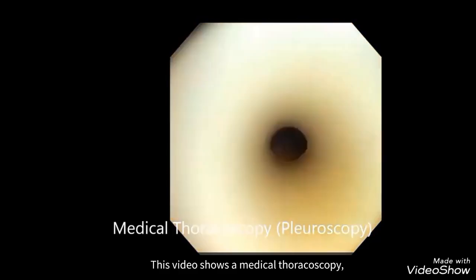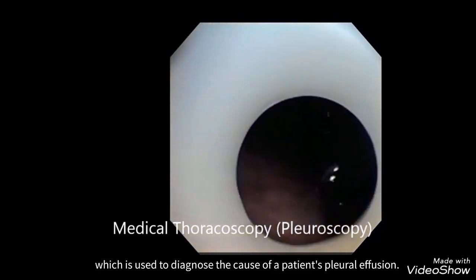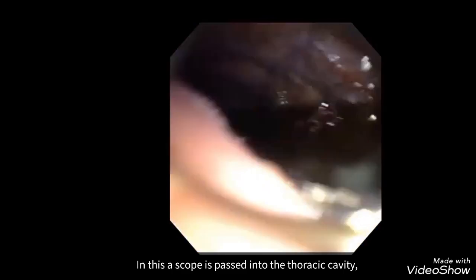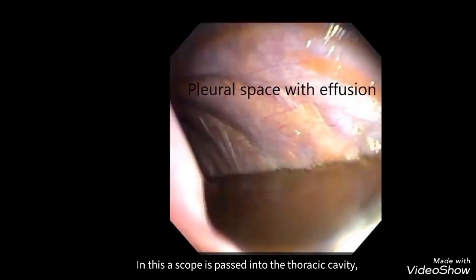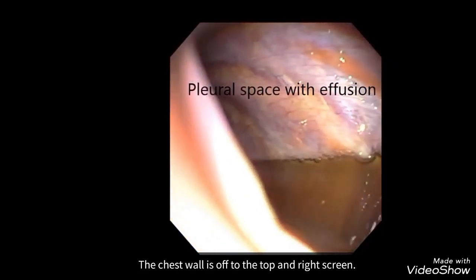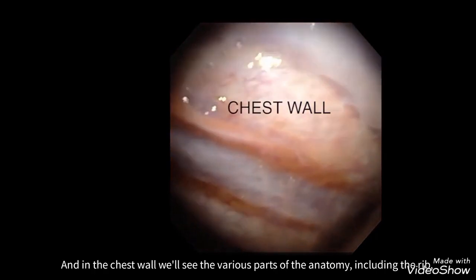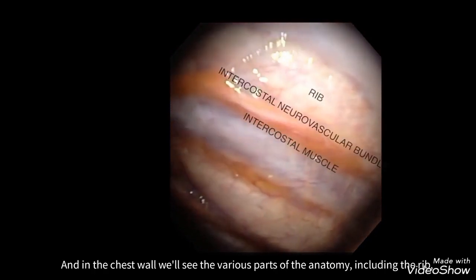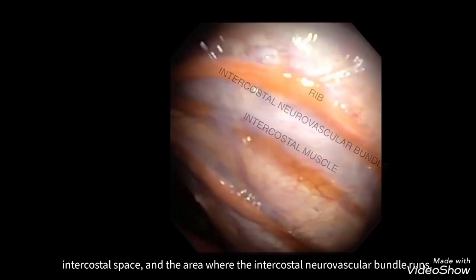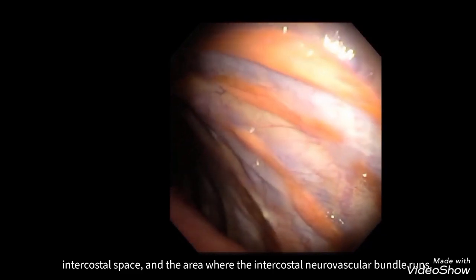Medical thoracoscopy, otherwise known as pleuroscopy, is used to diagnose the cause of a patient's pleural effusion. In this, a scope is passed into the thoracic cavity, and we can see here a pleural effusion, which is dependent. The chest wall is off to the top and right of the screen, and in the chest wall we'll see the various parts of the anatomy, including the rib, the intercostal space, and the area where the intercostal neurovascular bundle runs.